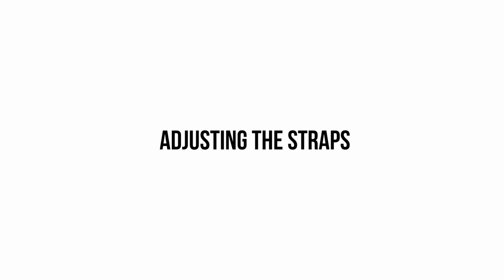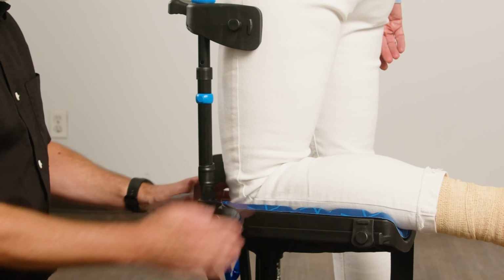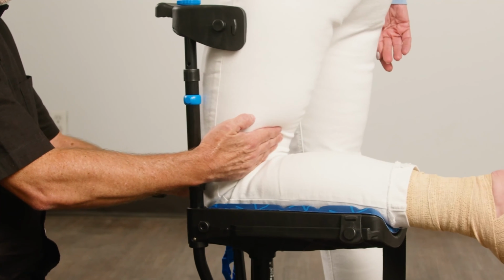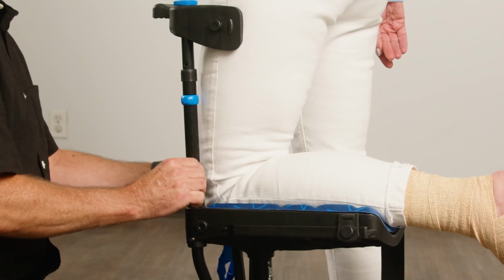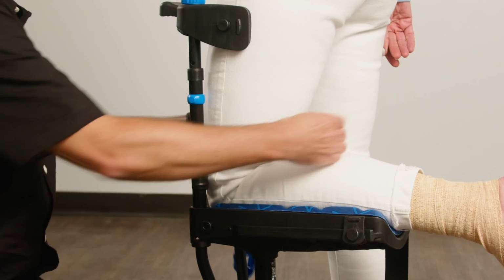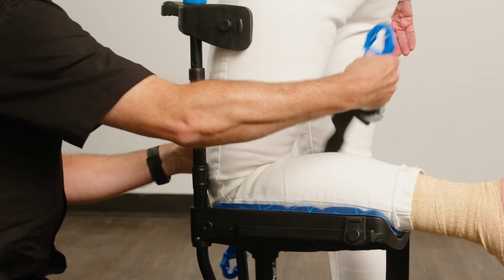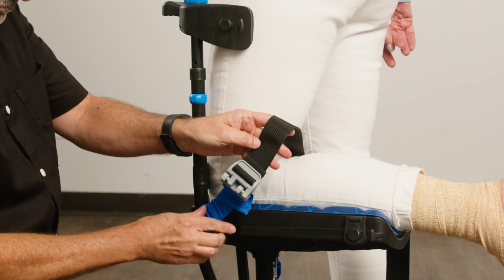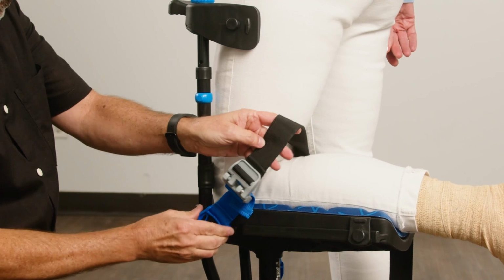Adjusting the straps. Now we will adjust the length of the strap so that it fits the patient. Have the patient kneel on the crutch while holding onto the handle for stability. Make sure the patient is fully forward on the knee platform. Their leg should be firmly against the gait strap. Start with the knee strap. Kneel in front of the patient and bring the strap over the back of the knee. Then attach the blue buckle to the knee platform.